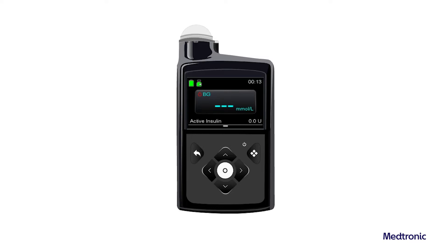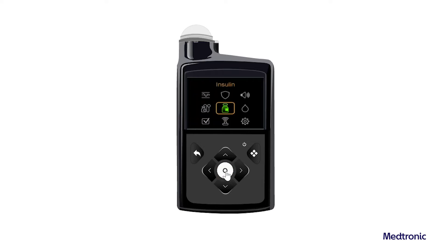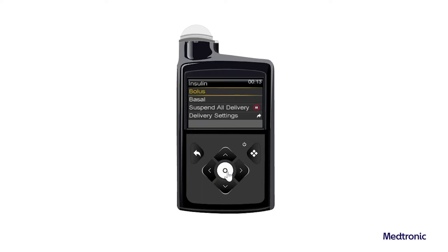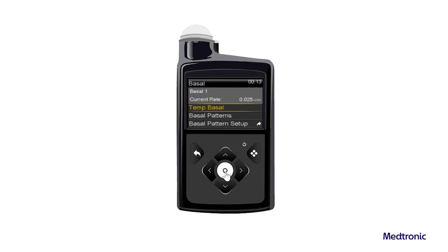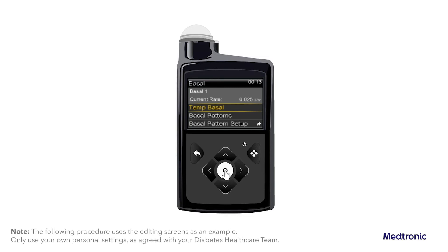To start a temp basal rate, from the home screen press select and then select insulin. Select basal and then select temp basal.